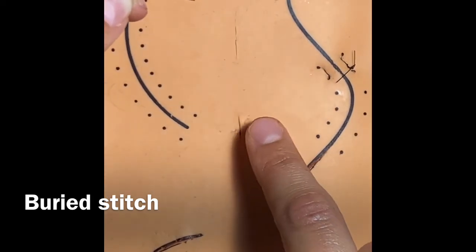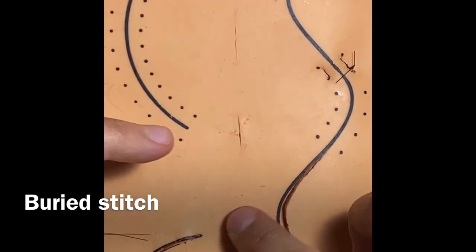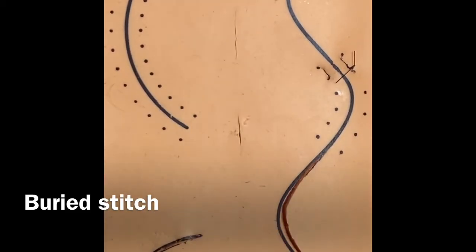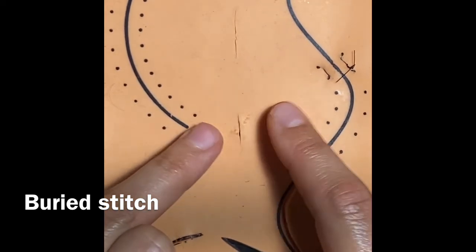And that way, you'll never cut the stitch. And see how, if you open it up, you can see my stitch buried there, but it kind of closes back together and you don't see anything on the outside. And that's ideally what you want, 1 stitch pulling that back together.